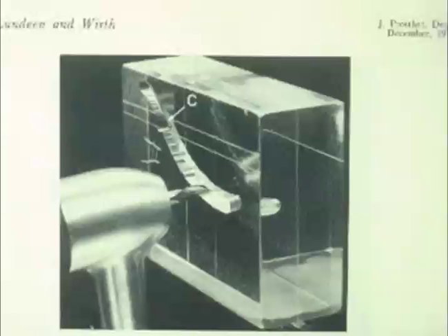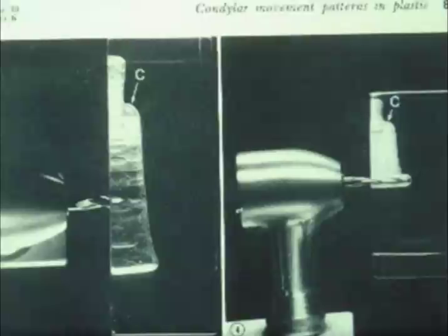Now he could view these solid resin blocks in 3 planes of space. Here's the vertical plane where we can see the patient's protrusive pathway. Then we can look in a horizontal plane here and see from point centric the Bennett movement coming inward and forward.